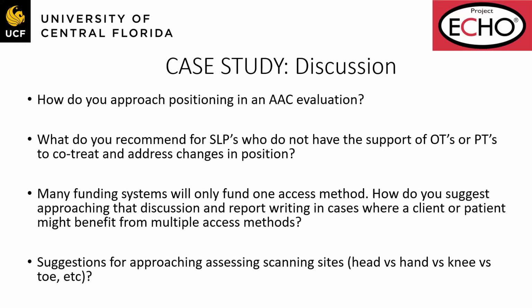Lots of observation and playing with the stuff. Adam has a big love of music, so we did a lot of music-based pages with switches and eye gaze, trying that same page set in our stander, over the prone wedge, in our chair, or in our gait trainer.